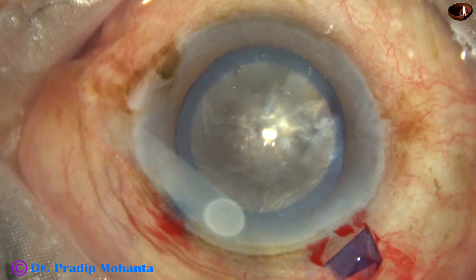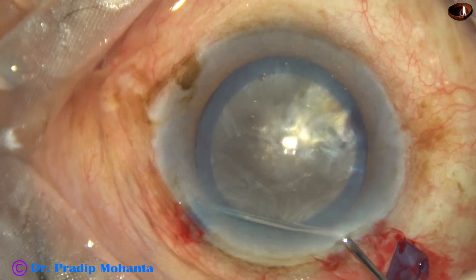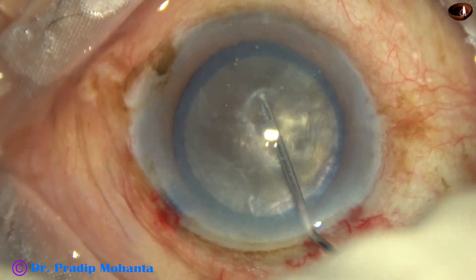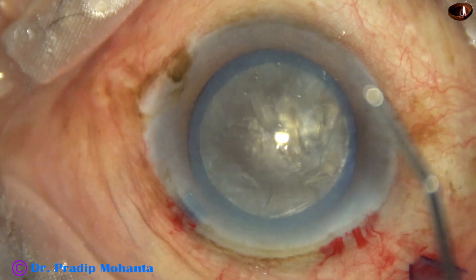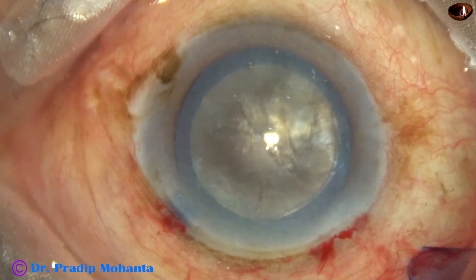And now hydrodissection is to be done. Small amounts of fluid are injected at multiple points. The nucleus is tapped gently, and the nucleus is mobile. I inject viscoelastic.